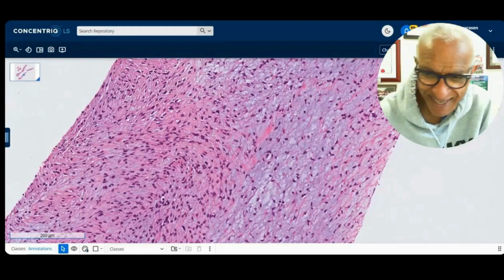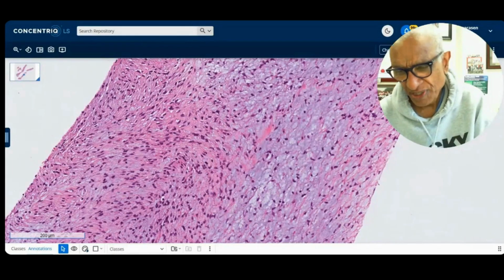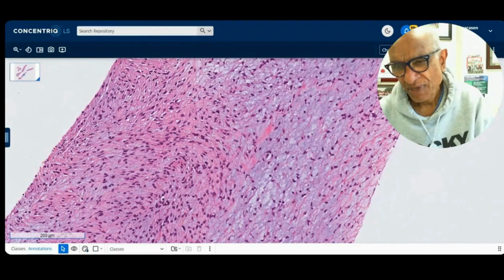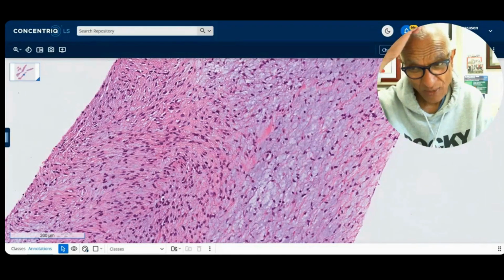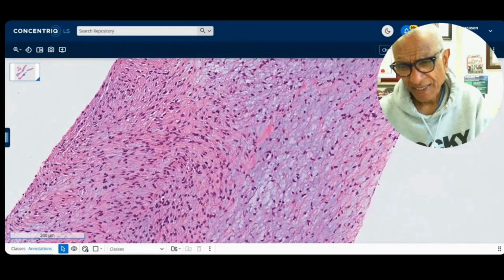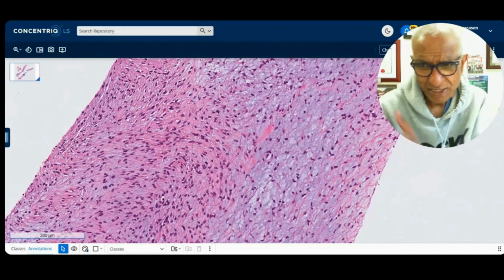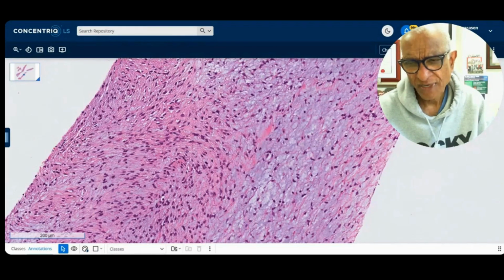SFT, well, we didn't even go in there, but that was my initial primary immunohistochemical investigation, CD34 and STAT6. But I did a MUC4 as well. Ischemic fasciitis, yeah, some of these can look fasciitis-like, but remember that ischemic fasciitis typically occurs in sites of pressure, like the sacrum. I guess the shoulder could be pressure-related if the patient was bedridden and not turned often enough.